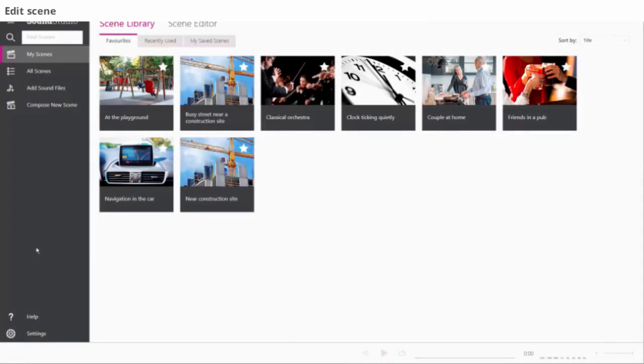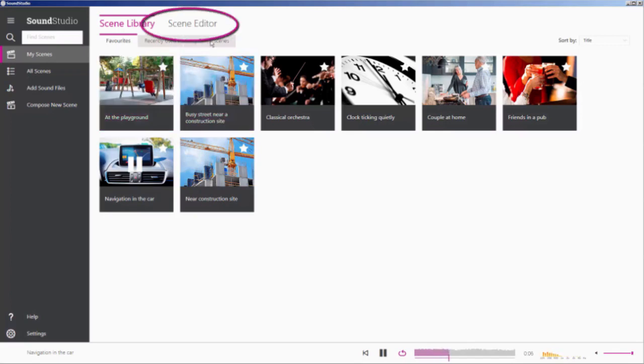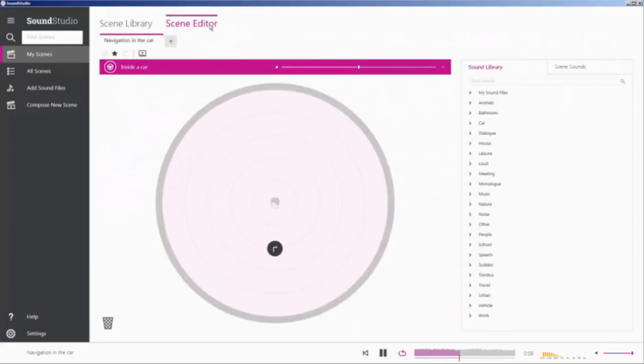The scene editor allows you to edit existing scenes or compose new scenes using the sounds and background sounds in SoundStudio. This can help you create personalized scenes. Click the Scene Editor tab in the top row of the screen to start editing. You can access the editor at any time, even while playing a scene. This is handy in case you need to change the composition of the scene during the fitting session.